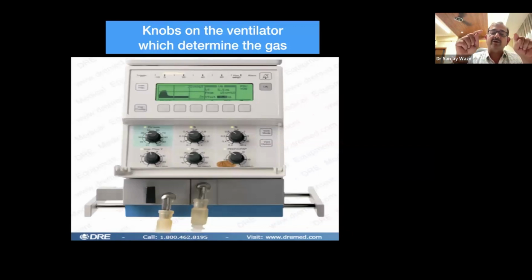But because Ti plus Te is equal to the rate, if you have to change the rate, either you have to change the Ti or you have to change the Te. Now Ti would remain more or less constant. So for changing the rate, you would end up moving the Te. Some ventilators have a direct option of changing the rate from 40, 50, 60. In that case, those ventilators do not have a separate TE, they have a TI setting.